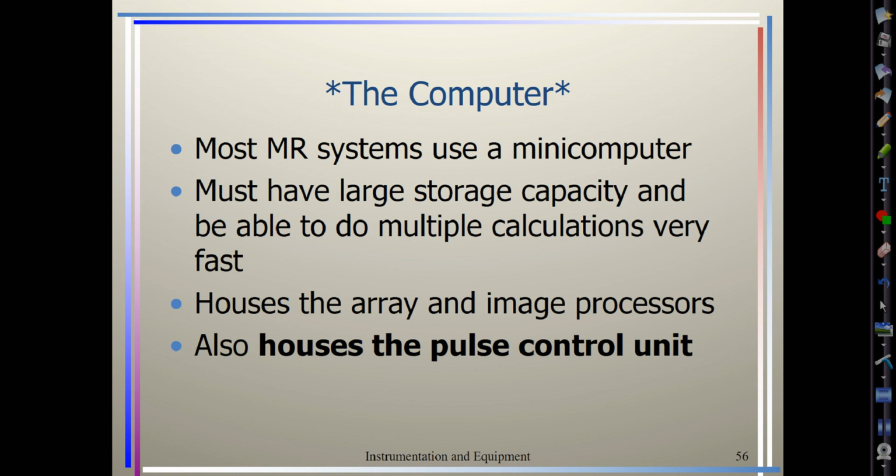If you do 8 patients a day, you could have 1,000 images in a day. Most of the time, technologists don't clean out their storage for long periods of time. So if you start to see your computer lagging behind, it could be a storage issue where you're hitting the limit of that computer's capacity.